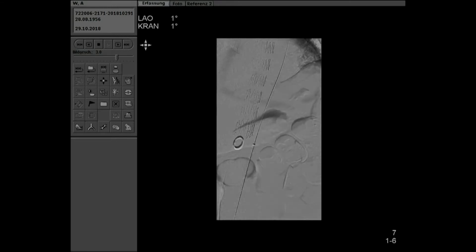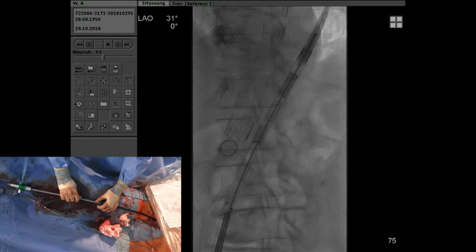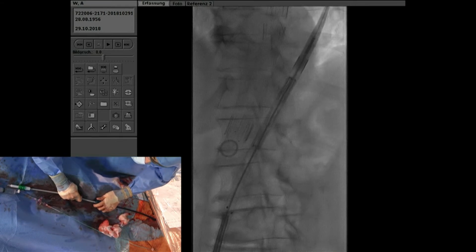The candy plug position should be aligned distally with the true lumen stent graft into the false lumen to act as a counterforce and also prevent stent graft induced new entries at this level. And here we see the candy plug in position. So this is the perfect position. It's also crucial to get a nice angulation where you can see the separation of the true and false lumen.